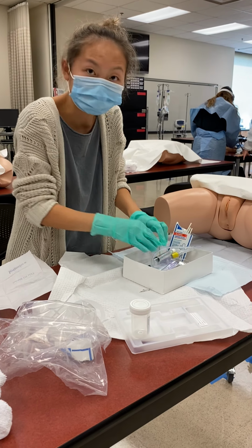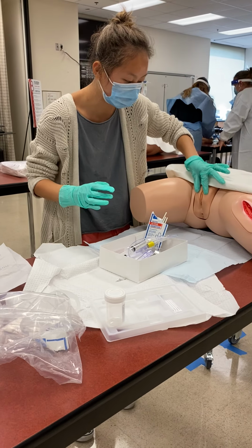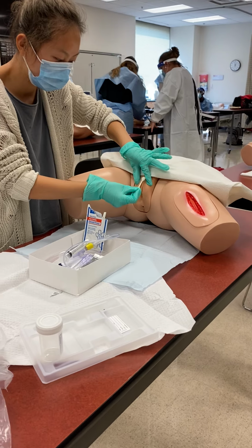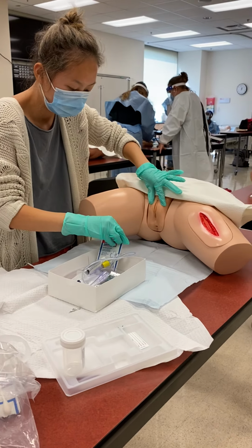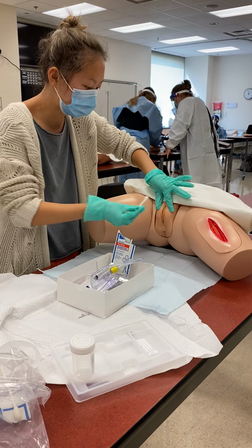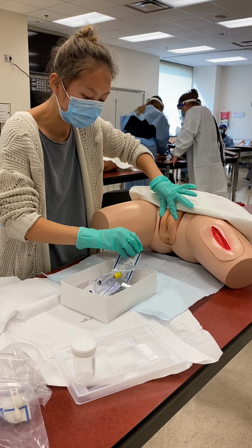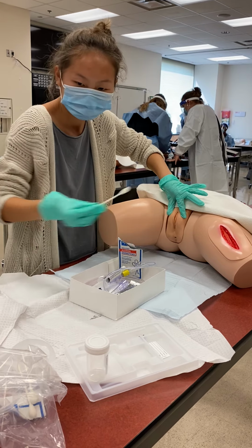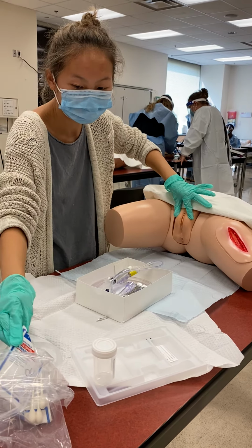And then we're going to leave it in the box. So I'm going to take my non-dominant hand and hold the labia apart. And so we want to make sure that we're cleaning this. So we got our outside swab, and then we'll throw it away. And then we have our other side swab, throwing away. And then our last swab, and this will be down the center. And then we can throw this away now. We're not going to use this anymore.